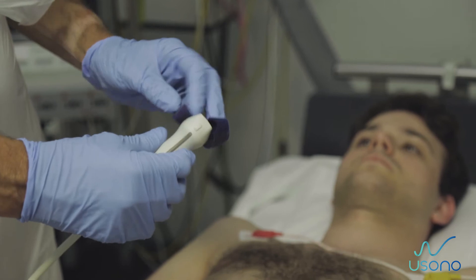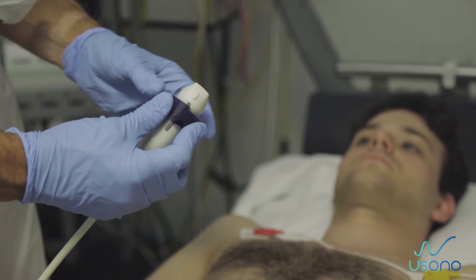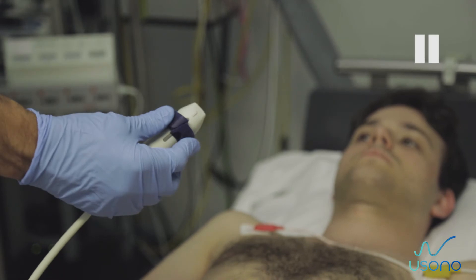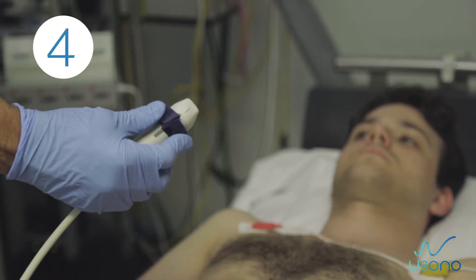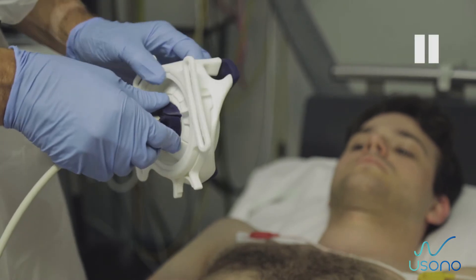Fit the silicon ring insert around the probe and adjust it until the shape fits perfectly. Step 4: Insert the probe and silicon ring insert into the probe fix. To install the probe in the correct position, match the indentation in the silicon insert with the protrusion in the probe fix.